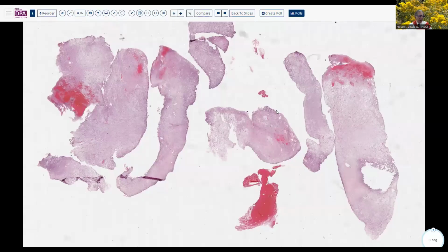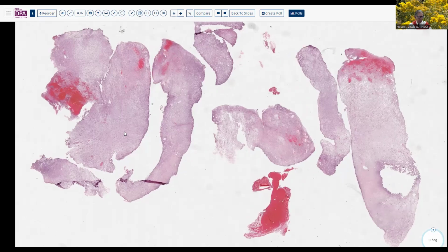So we're going to talk today about a number of soft tissue tumors that can have an inflammatory component. This is, I think, a challenging area for pathologists in some respects because many times the inflammation can be deceptive, and we think that this is truly an inflammatory process rather than the more ominous and potentially life-threatening neoplastic process. So here's the first case. This is a retroperitoneal lesion.